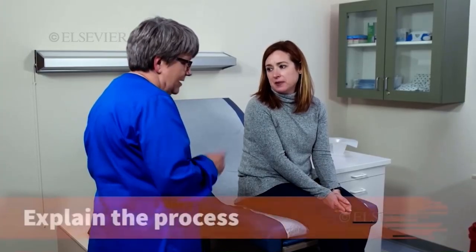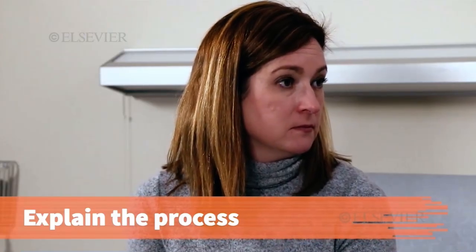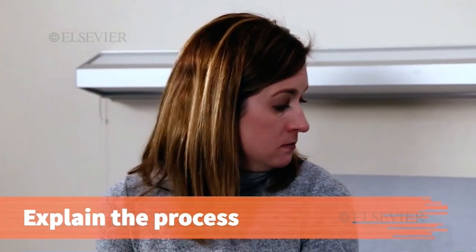Dr. Anderson wanted me to explain to you how to collect a 24-hour urine specimen. Explain the collection procedure to adult patients and guardians of pediatric patients using the following instructions.